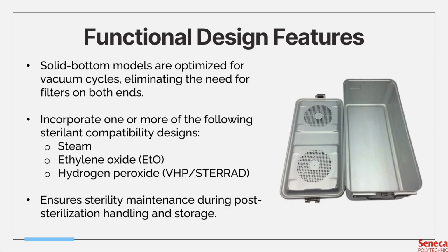So these features ensure that even after sterilization, the barrier remains intact during handling and storage. So this functional design makes rigid containers versatile, durable, and ideal for high volume hospital use.